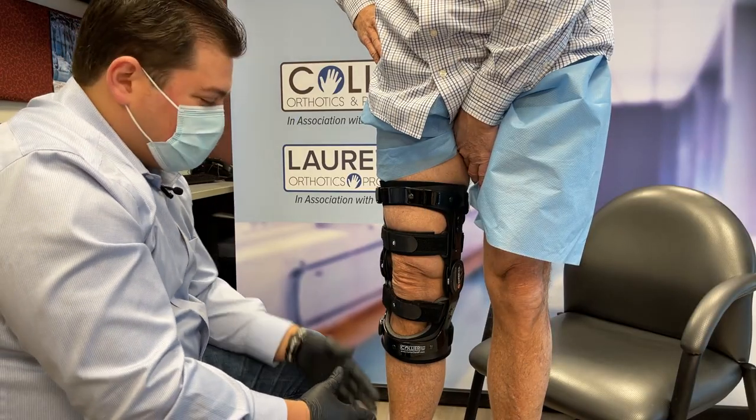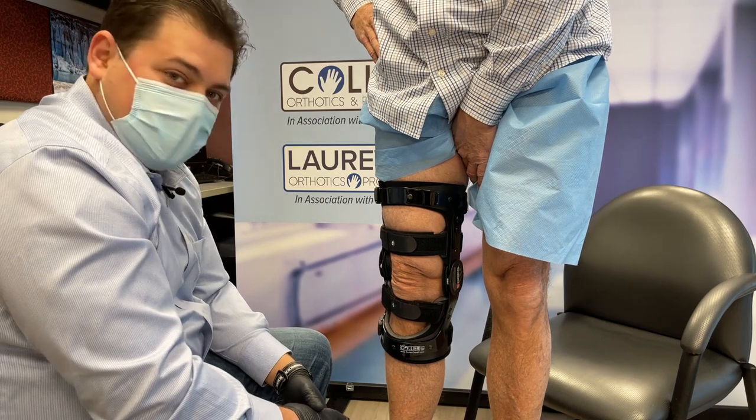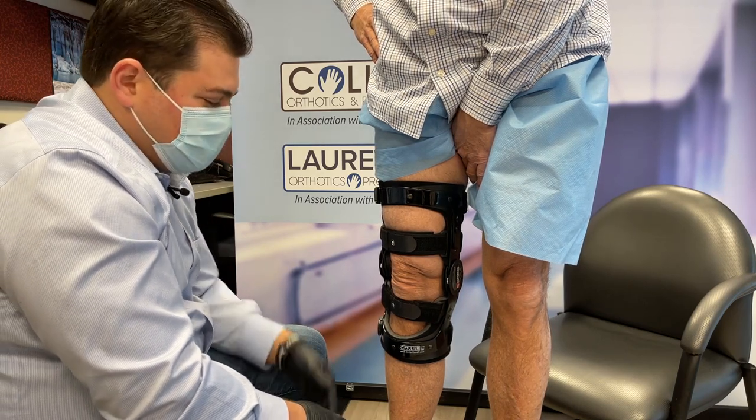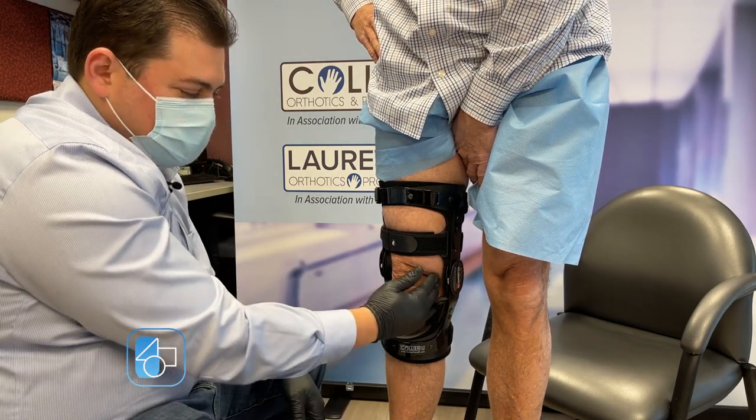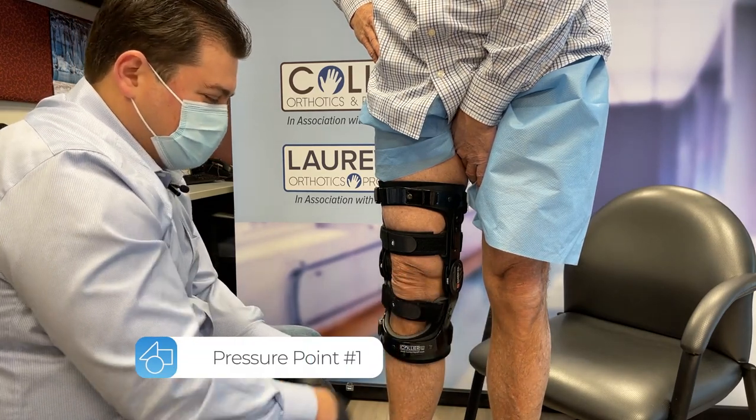With the patient standing, we're going to check that the offload we're applying to this patient's leg is adequate for their specific needs. We're trying to push this knee over to unload the inside of the leg for medial OA. If we were using the brace for the opposite, we'd be pushing it outwards for lateral OA.